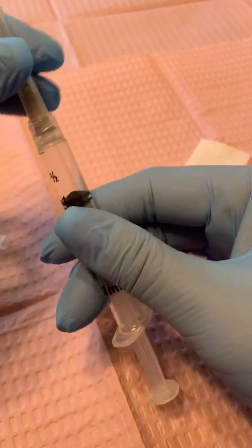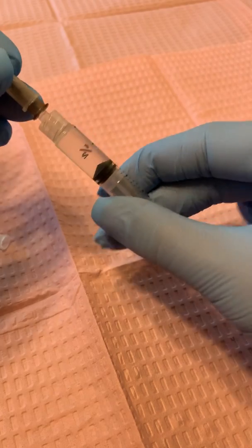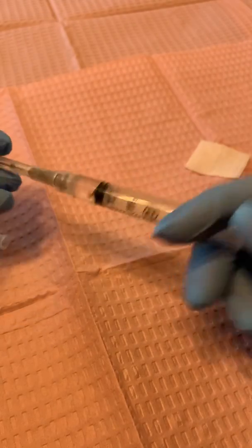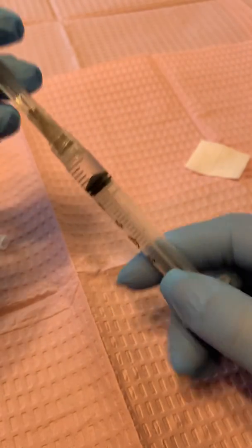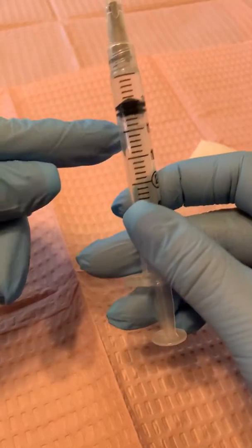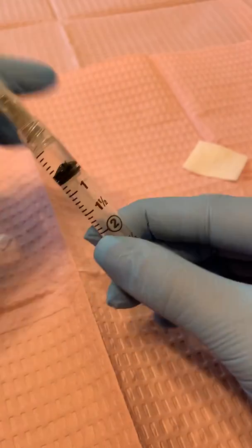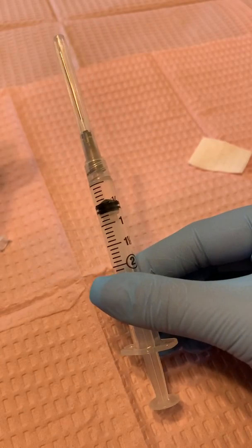Let me show you what happens if you accidentally don't luer lock it tight enough. Let's see if you can see the medication kind of leak out. It's not really showing you well, but I lost half my dose there — that's okay, this is just demo purposes because I want to show you how to draw it up. So now it's capped and we're ready to go.